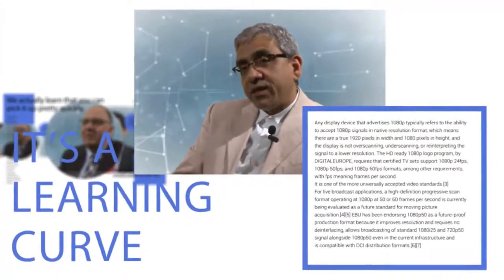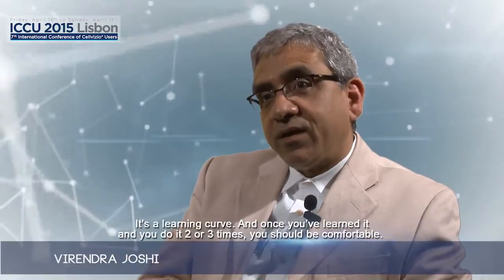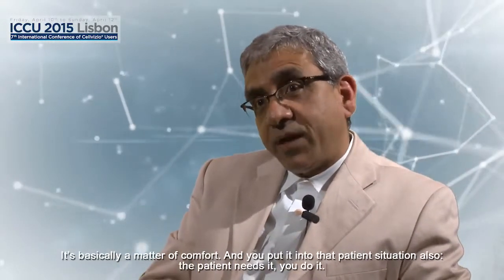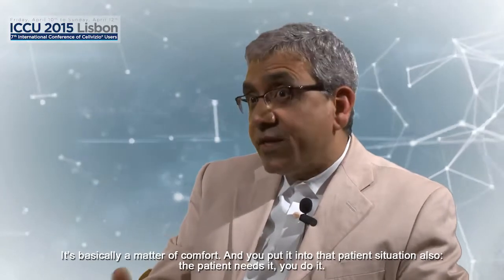We actually learned that you can pick it up pretty quickly, but you have to be motivated to do so. It's a learning curve, and once they learn it, you do it 2 or 3 times, you should be able to be comfortable enough. It's basically a matter of comfort, how well you put it into that patient situation also. If the patient needs it, you do it.